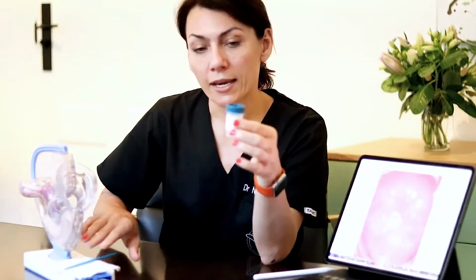A pathologist would look, or a special machine nowadays will assess the sample and we'll get a result. The result may come back as normal or abnormal. Abnormality may have different stages. It could be CIN1 or low-grade abnormality, or CIN2 or 3 high-grade abnormality, or cancer. However, cancer we generally can see with our eyes, and we'll probably do a different test such as a biopsy for cancer.